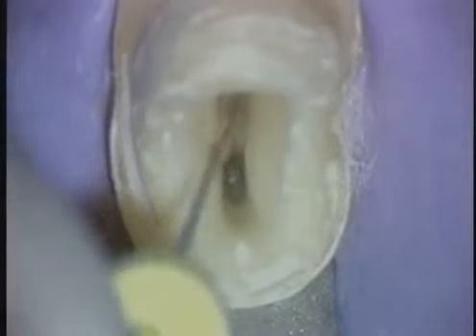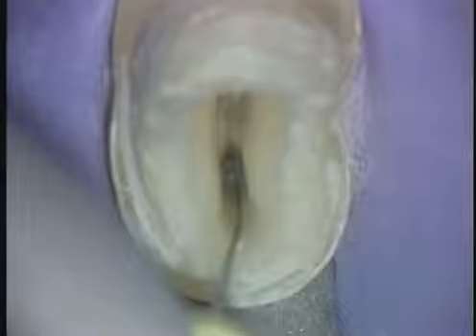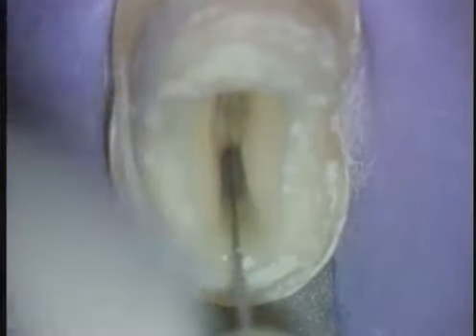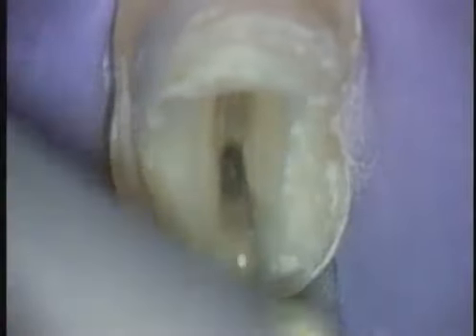Irrigation sets the stage for getting the file into the right canal, and once we can slide down that wall and get into the orifice, we can begin to notice a little handle flutter, and this typically suggests we're beginning to track the system. Obviously, radiographs are going to be useful to confirm that we are in a missed canal, and the radiograph confirms the second system.